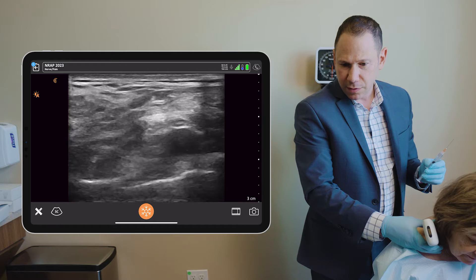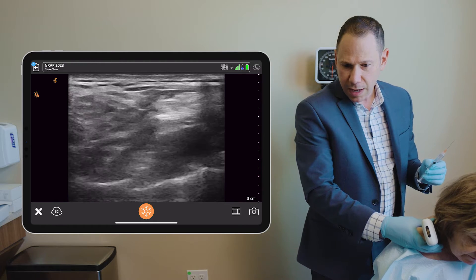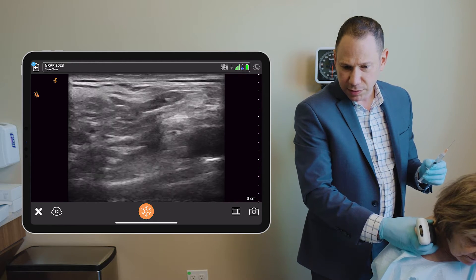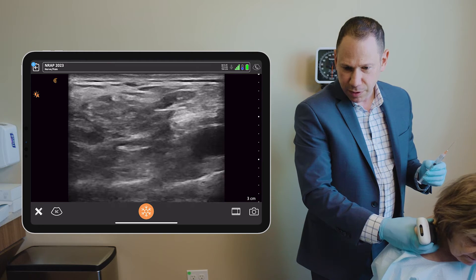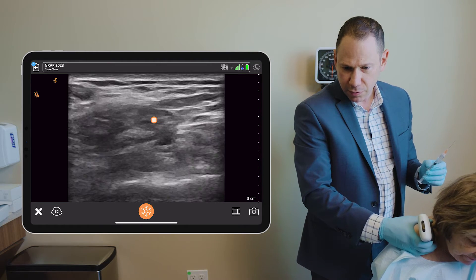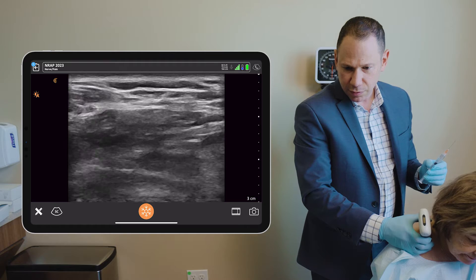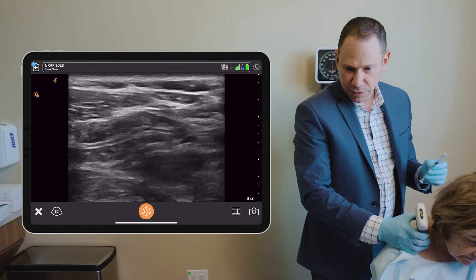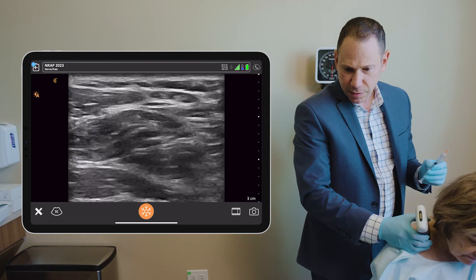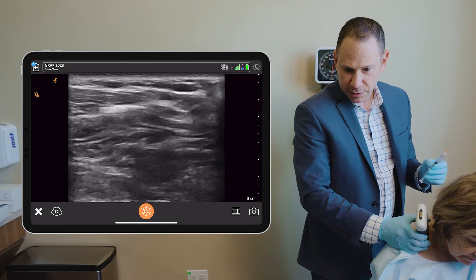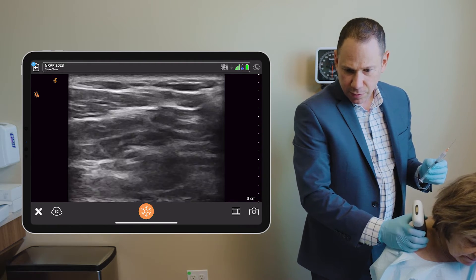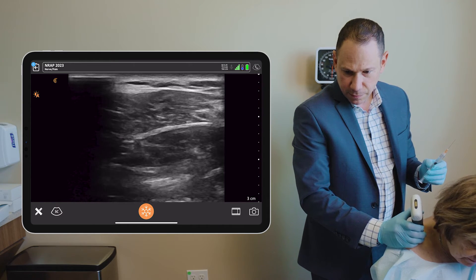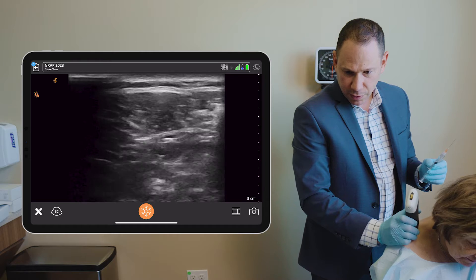So now we see the nerves around the artery, and sometimes we can trace the suprascapular nerve as it leaves the brachial plexus right here and goes more posteriorly towards the notch of the scapula, and then under the supraspinatus muscle. We lose it as it gets deeper under the trapezius posteriorly over here.